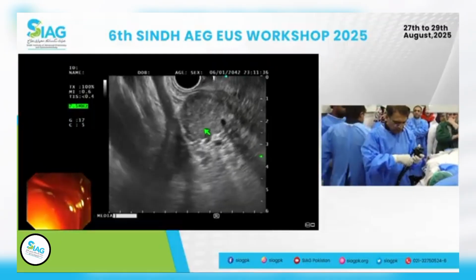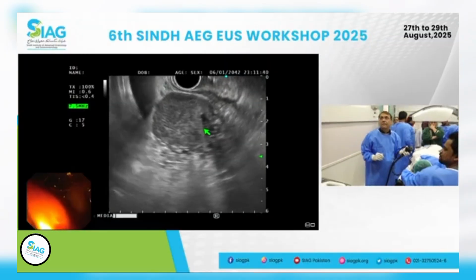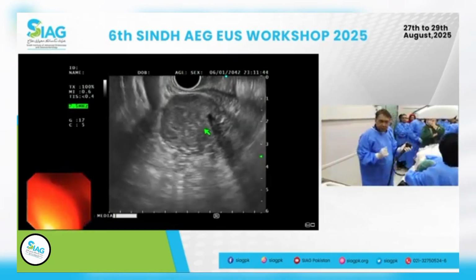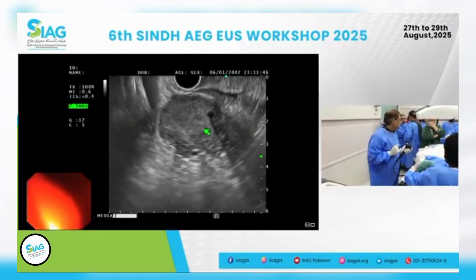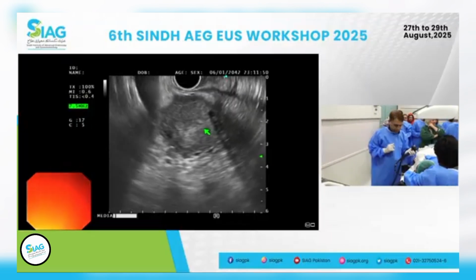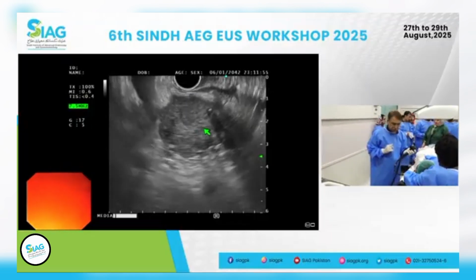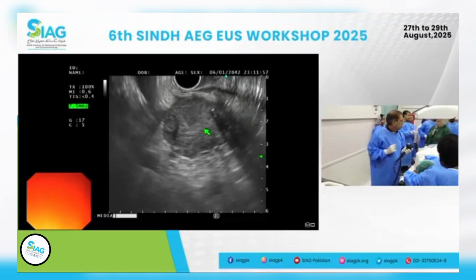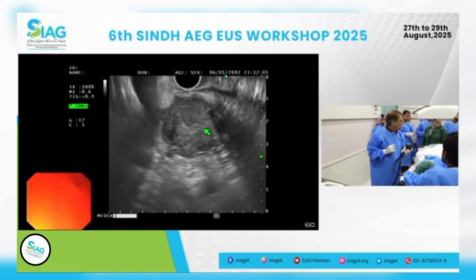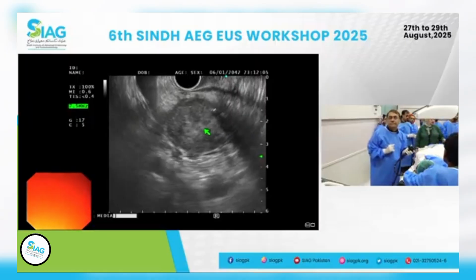Thanks, Khalid. Excellent demonstration. Khalid, one of the things that you just mentioned about the needle sheath, the catheter, I think it's important, sometimes when you're trying to insert the needle, especially in T2 or a slightly odd position, scope turned or more flexed, and if you feel that there's a resistance to the needle as it comes out, it's important to actually see where your sheath is.